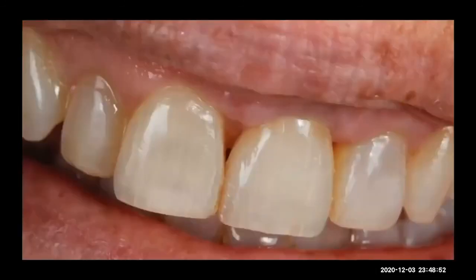So you can see another view of the crown. It's not perfect, but it's a difficult case. It's a tough case. I can guarantee that if we build this crown, we need to do it like 2 or 3 times to get close to the original color.